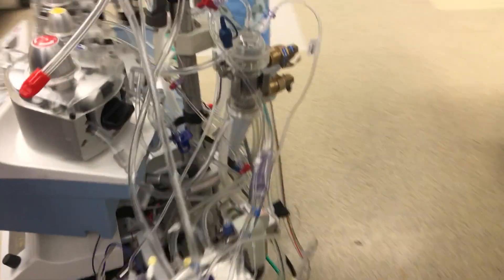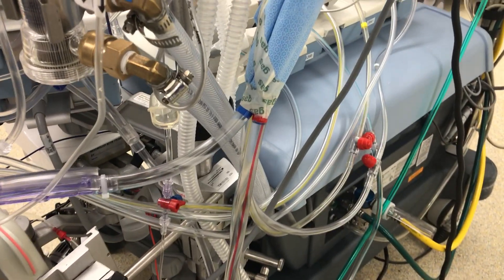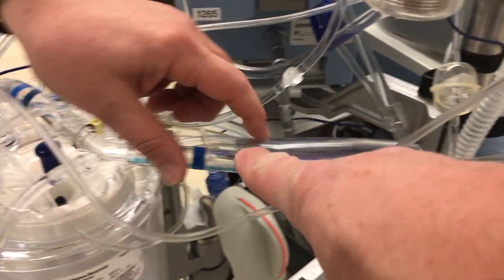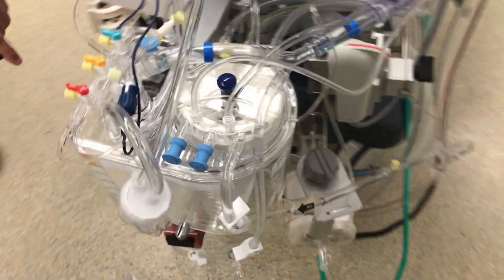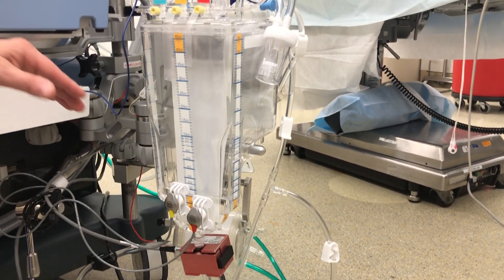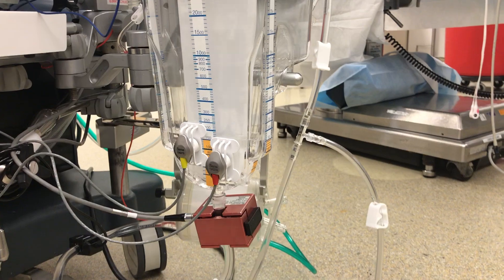We start when the surgeon puts the cannula into the right side of the heart to drain the dark, deoxygenated blood out of the body, which comes through this tubing into this reservoir that will flow into the blood pump and into the artificial lung. This reservoir here is where the fluid comes. We have a small amount of suction on it to help drain better through smaller tubes, but the blood comes here, and what we have here is what we have to work with.